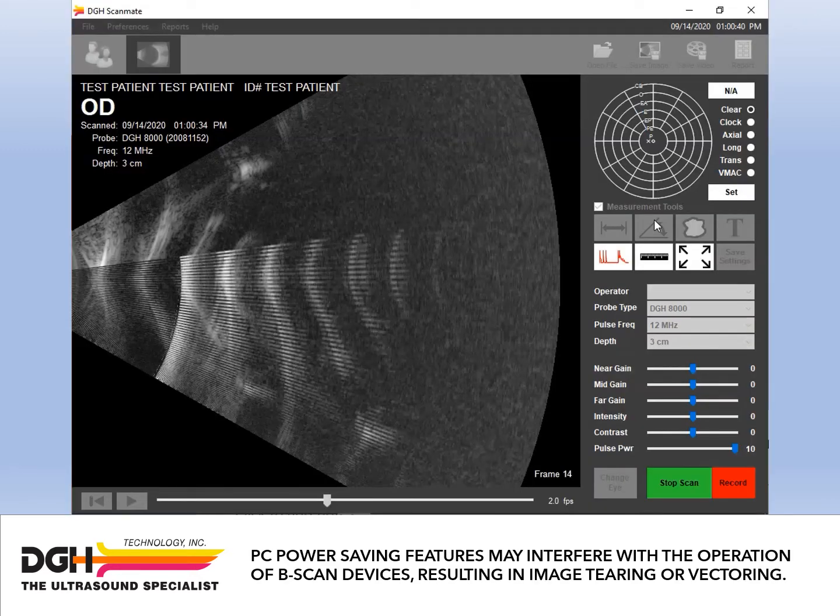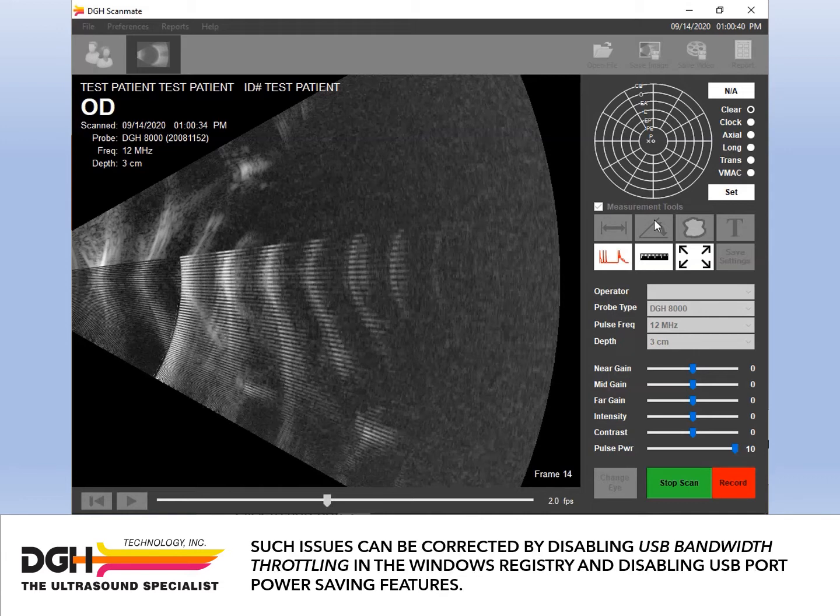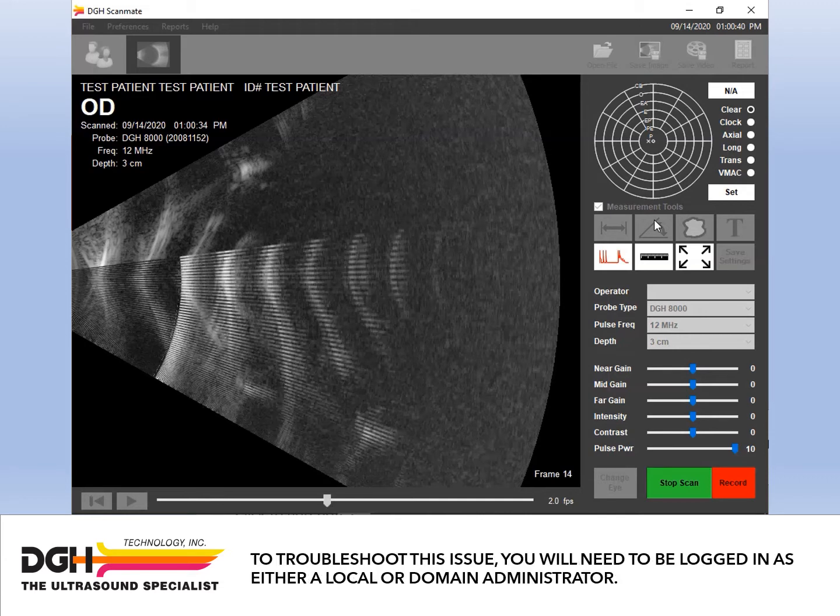PC power saving features may interfere with the operation of bscan devices, resulting in image tearing or vectoring. Such issues can be corrected by disabling USB bandwidth throttling in the Windows registry and disabling USB port power saving features. To troubleshoot this issue, you will need to be logged in as either a local or domain administrator.